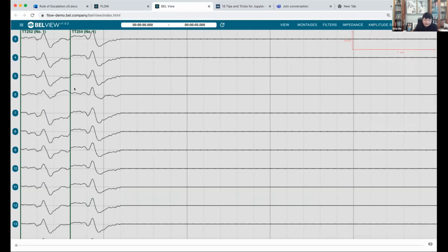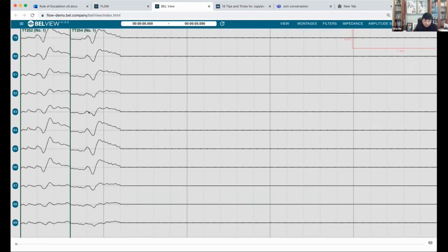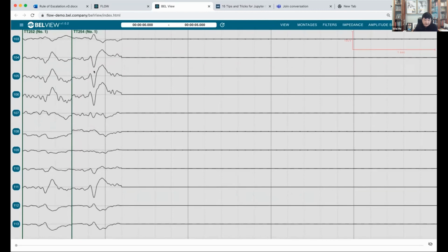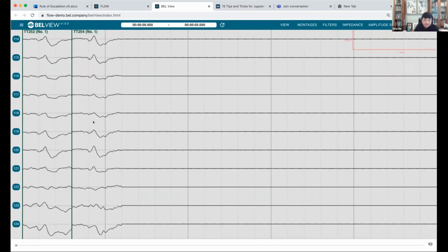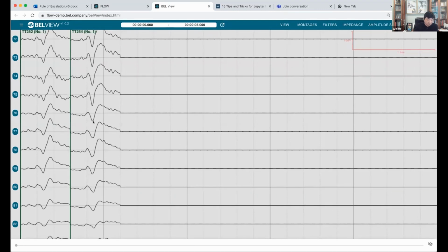Now, what you see here is the typical N170, especially in the occipital region here. These are the face versus a character. You see the face has a clearer, bolder, and larger deflection negativity at the N170, at the 170 milliseconds time point. So this is just a very quick demonstration of what you can do with the flow.